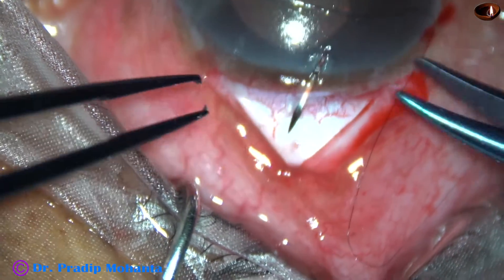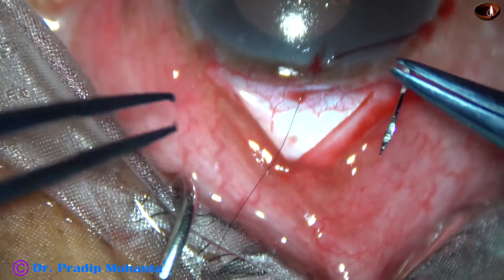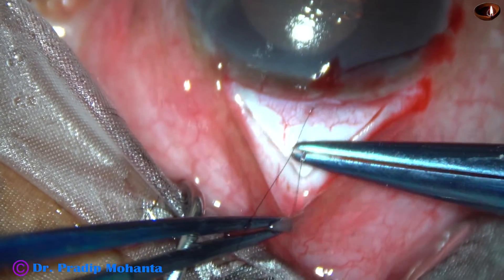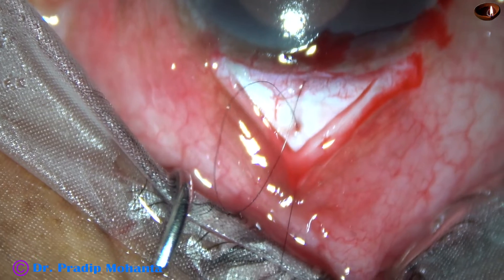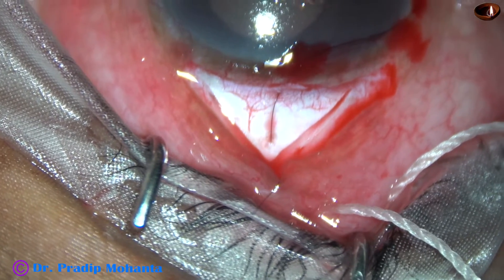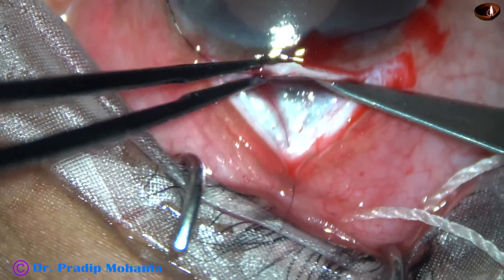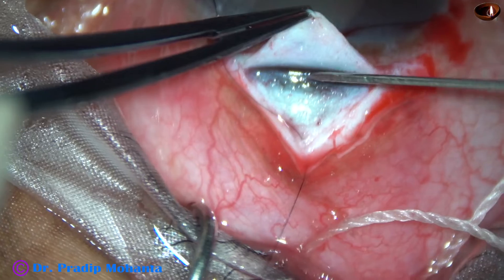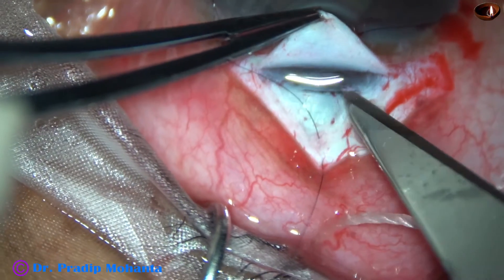Now I am placing a pre-placed releasable suture at the apex. This portion of the video is at one-and-a-half times speed. This is the pre-placed releasable suture. Now I take a number 11 Bard-Parker blade and I am going to excise a piece of sclera which contains the trabecular meshwork.